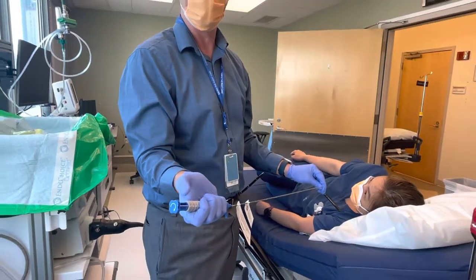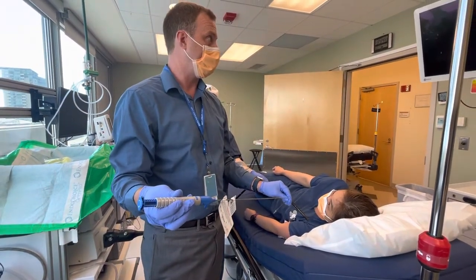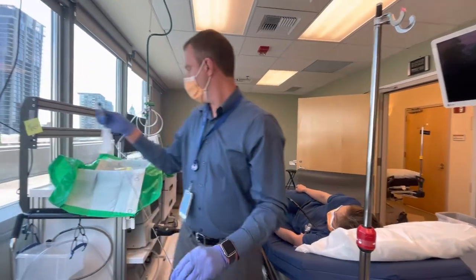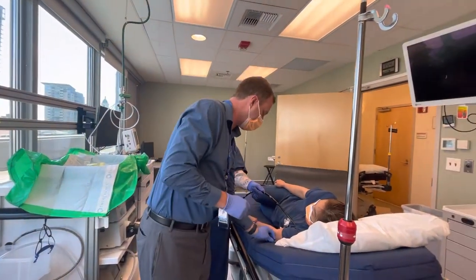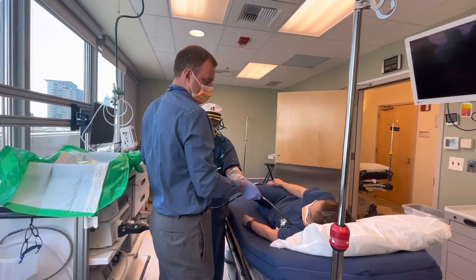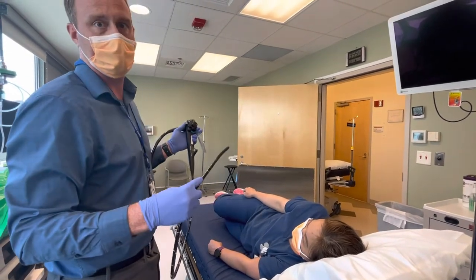You can kind of feel the pop when you do that, as long as it's loose. Then I'll have them turn off suction, look at the screen, and pull it out to verify it popped off. I'll take the scope back from the nurse, go down — only five to ten centimeters — verify it's in place, come out, and done.